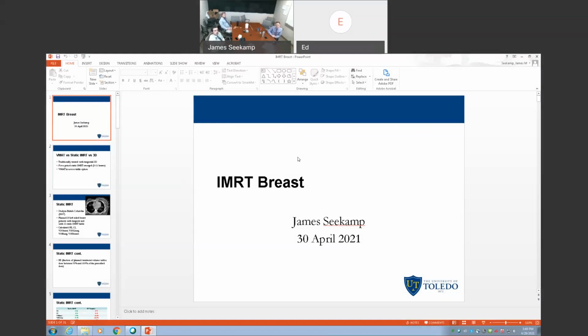Hey, Jimmy, I have a question for you. Yeah. Just a quick methodology thing. When you were doing the virtual bolus plans, did you try re-optimizing after you switched off the virtual bolus while allowing it to only edit the MUs per control point, not the aperture shapes, or did you not try that? No, I didn't try that. It's probably a smart idea. It bricks the computer for several hours. Yeah, I've done that in the past and I didn't like it. It'd be worth it to do it.